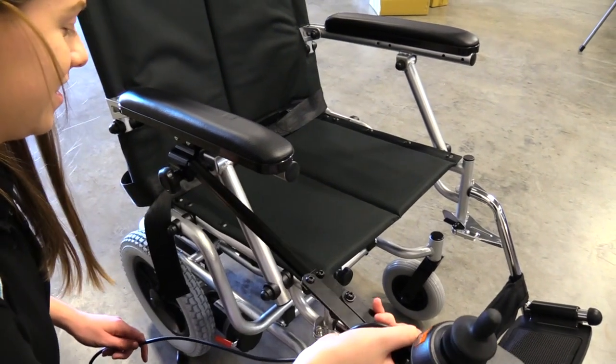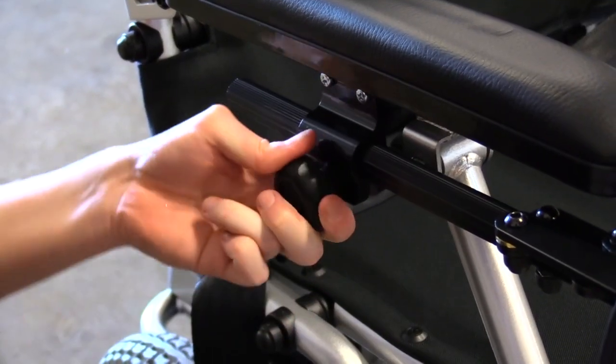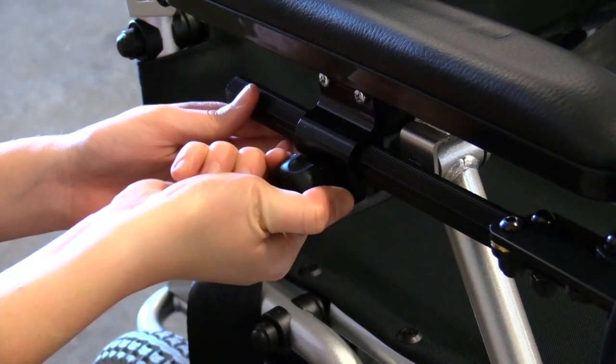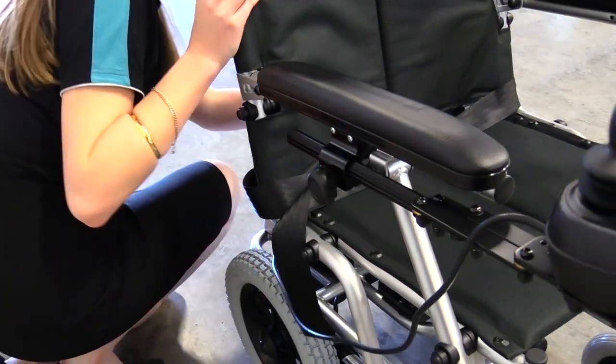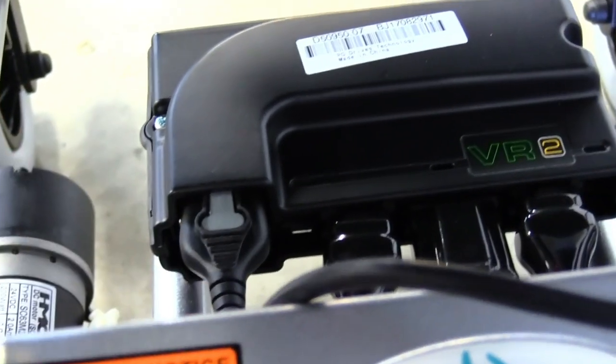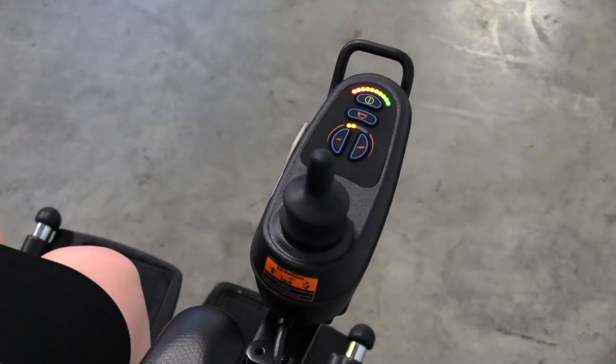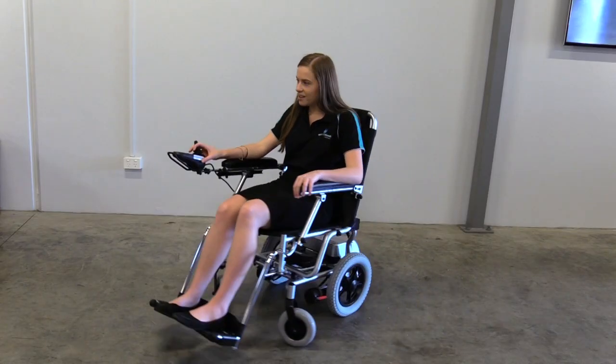To attach your control panel, slide the arm into the support bracket on the armrest. Tighten the knob to secure it. Connect the cable to the connector at the back of the wheelchair. Switch your Puzzle on to ensure everything is connected correctly. Your Puzzle is now ready to drive.